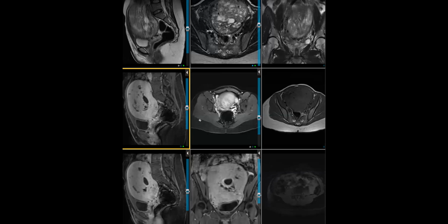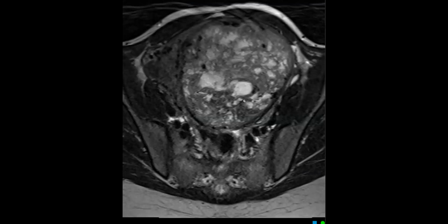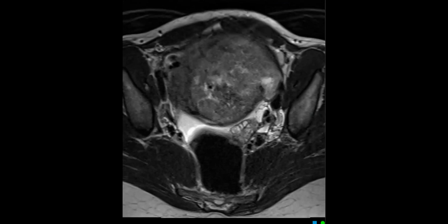Fiona's paper, didn't she say something about that finger-like projection that you saw? Yeah, actually, I have her paper up. I have a companion link for this. And that finger-like projection, right there in the left lateral border, is one of the features of leiomyosarcoma. Yeah, I don't like that border. Let me show you my screen. Is that cool? Go for it.